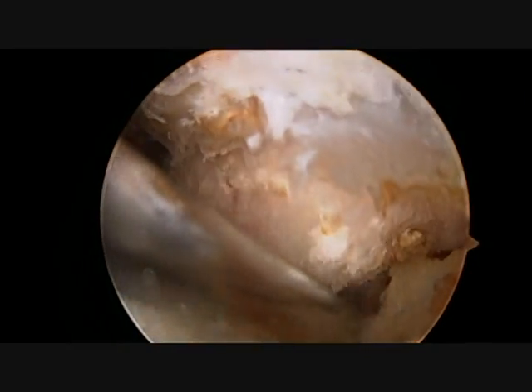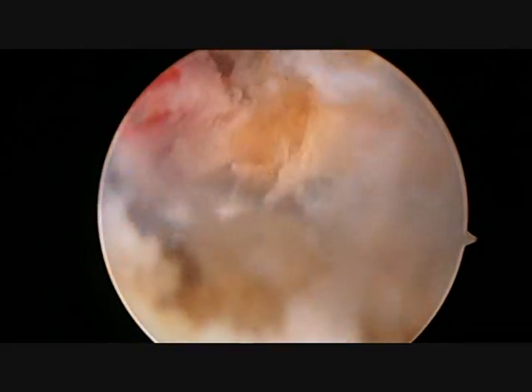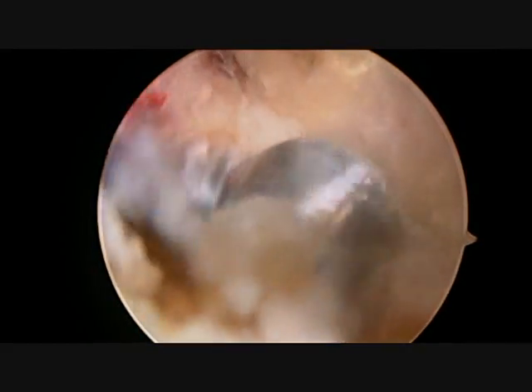A special instrument that vaporizes the tissue is then inserted to remove all of the soft tissue and debris from around the bone to allow complete visualization of the end of the clavicle.